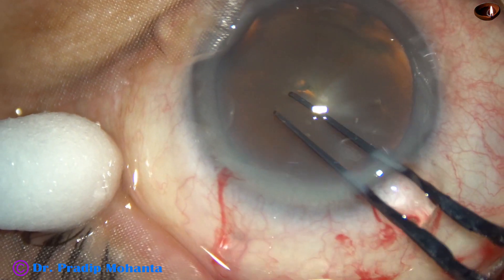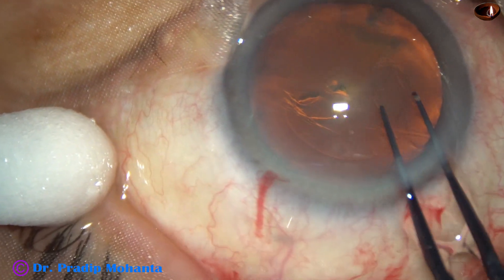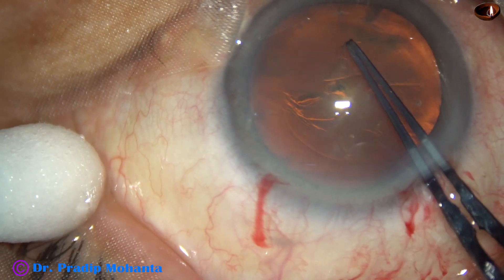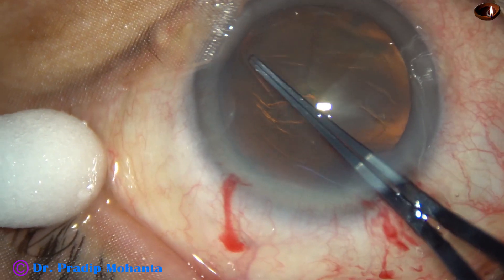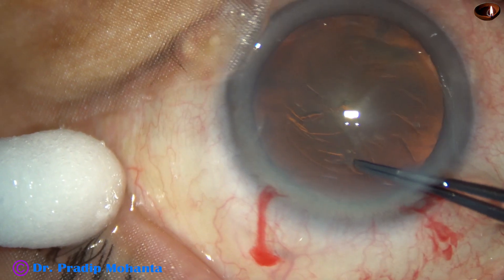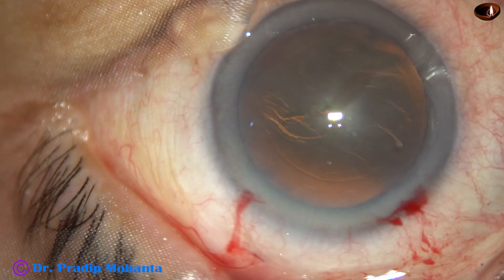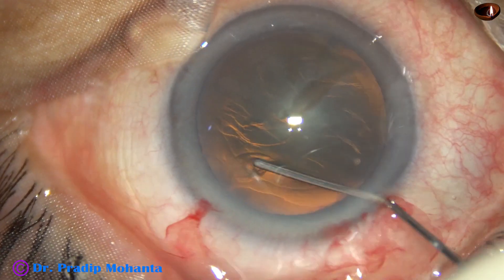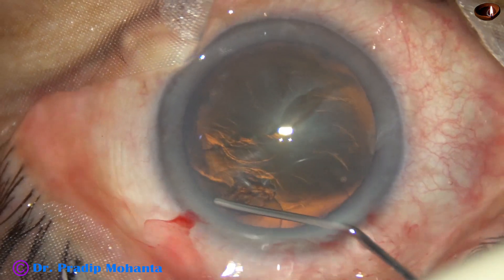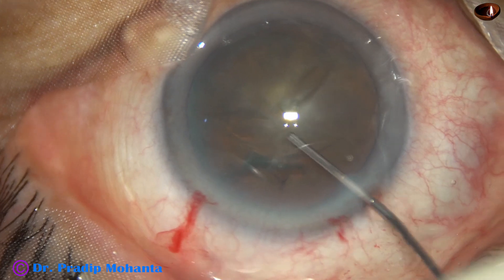Capsulorhexis is being done with the utrata forceps. A capsular tag is raised and the capsular tag is guided anti-clockwise all around to get an adequate size rhexis. Hydrodissection is done with a BSS and 27-gauge cannula.